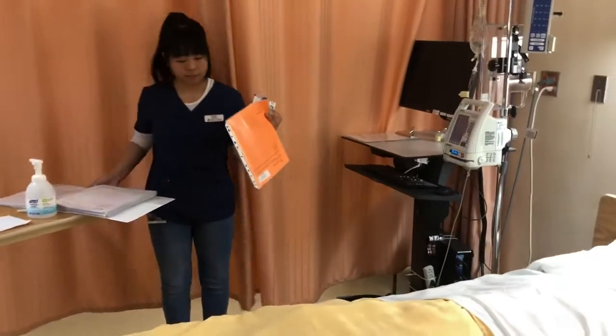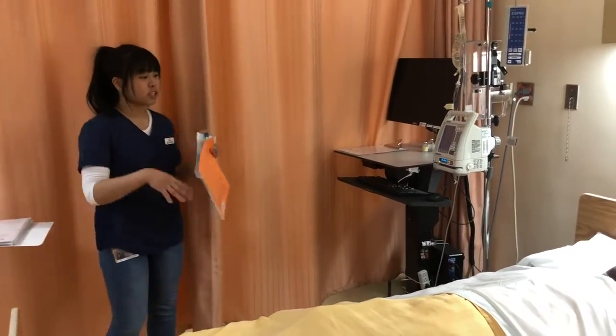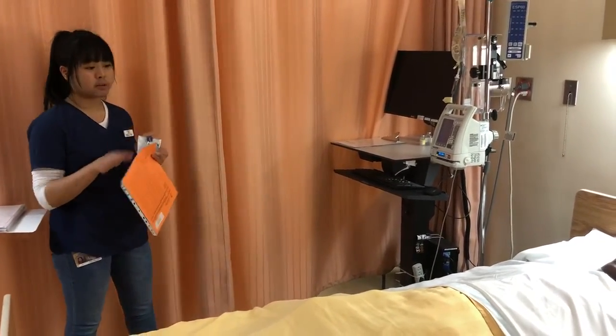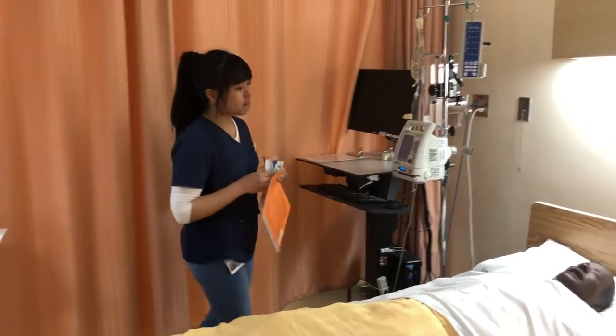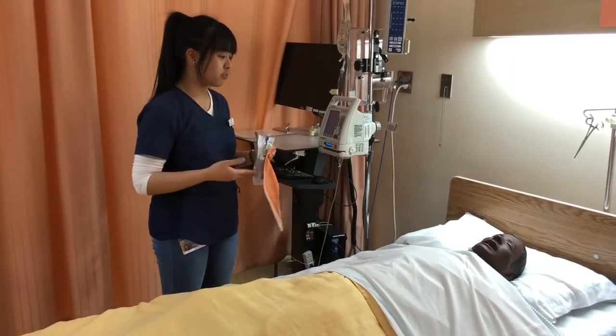So before I fully come in, I'll do my safety check. Patient's not in distress, bed's in the lowest position, and no safety hazards. And I'm just gonna wash my hands as well. So hello, my name is Rikka Yambao. I'm a third-year nursing student. I'm here to give you your medication.